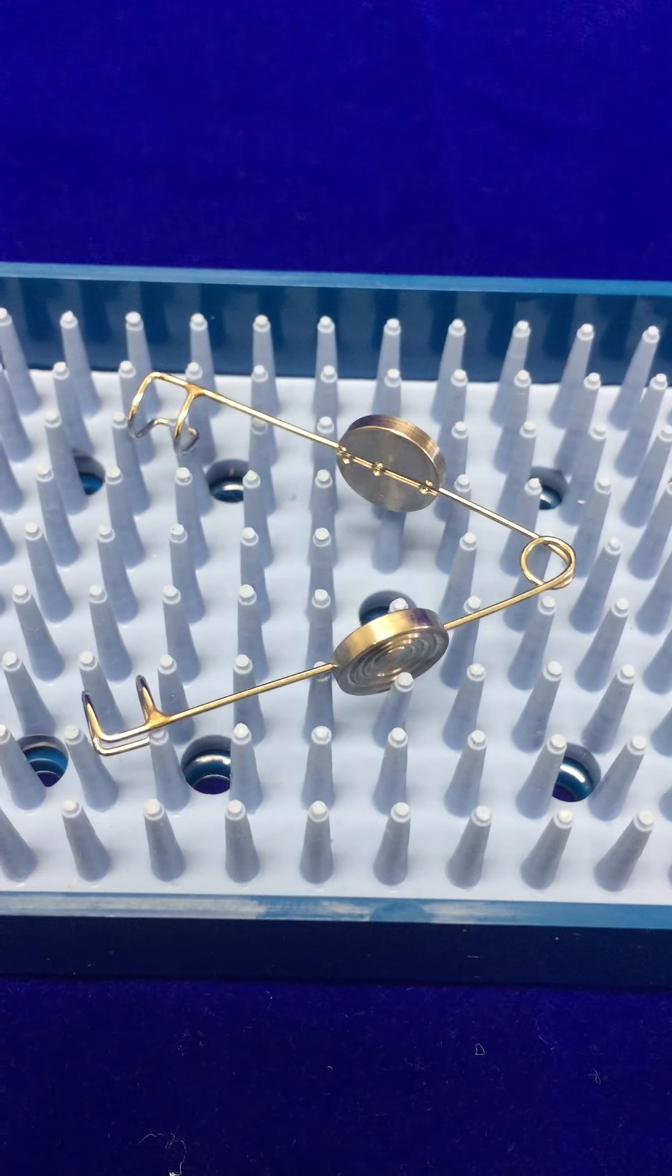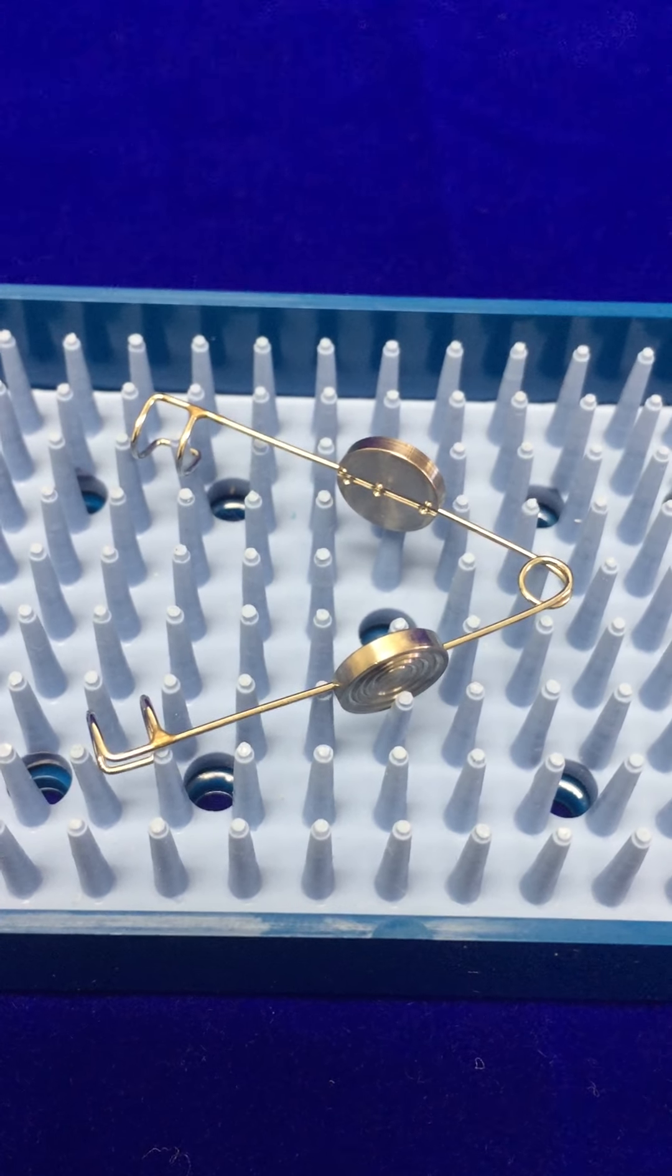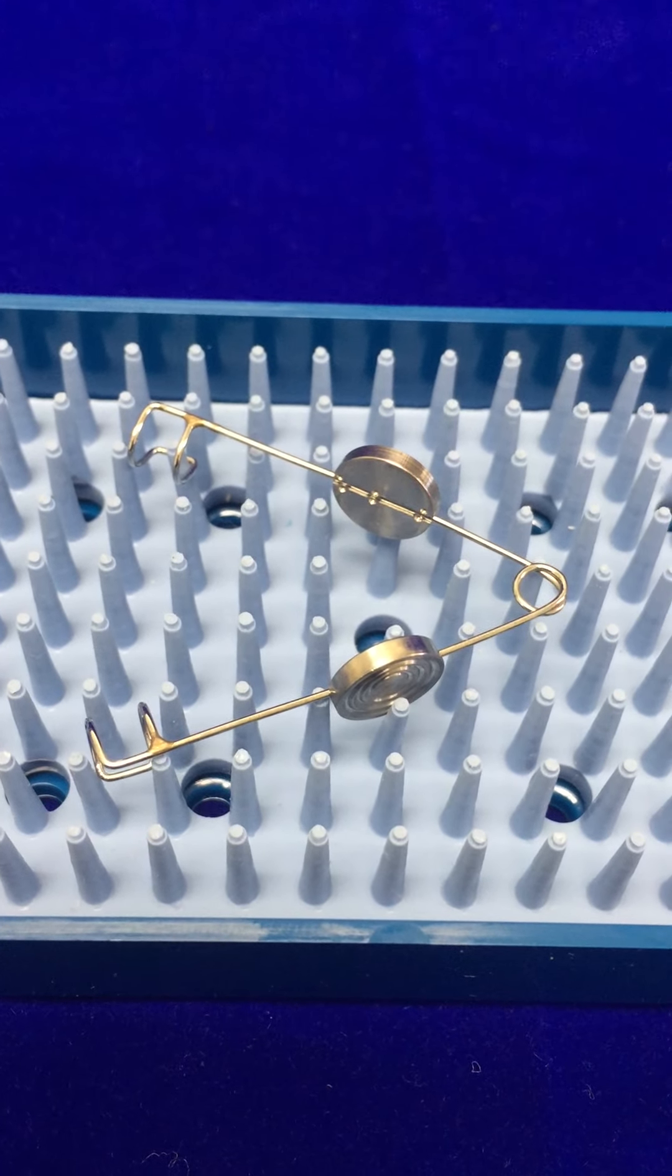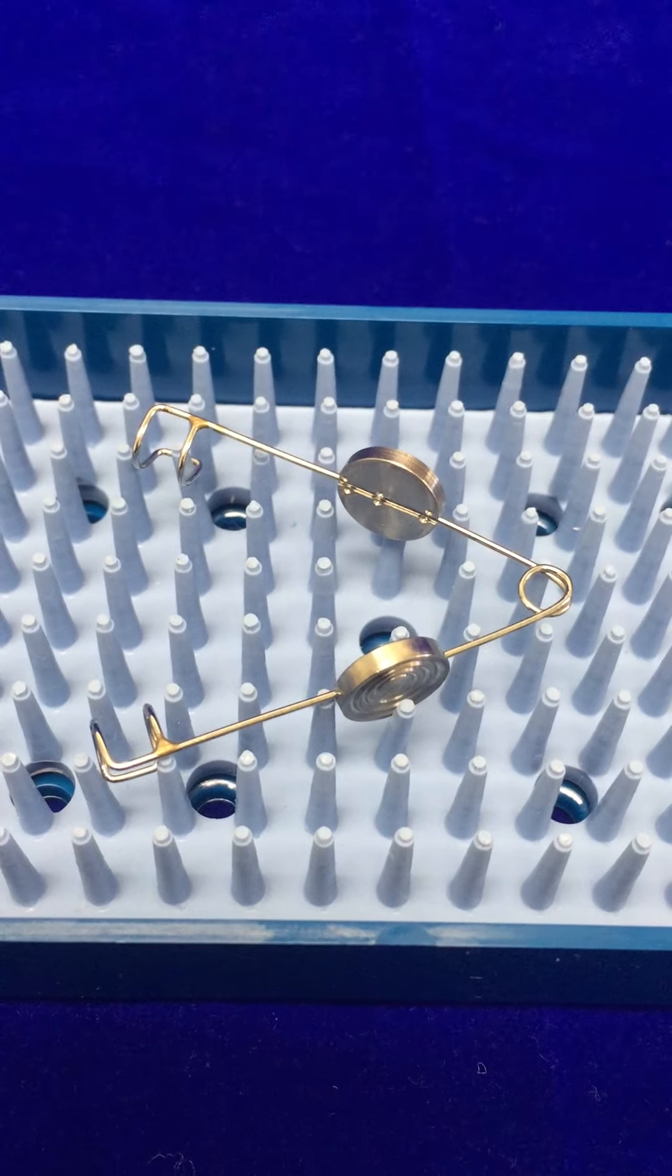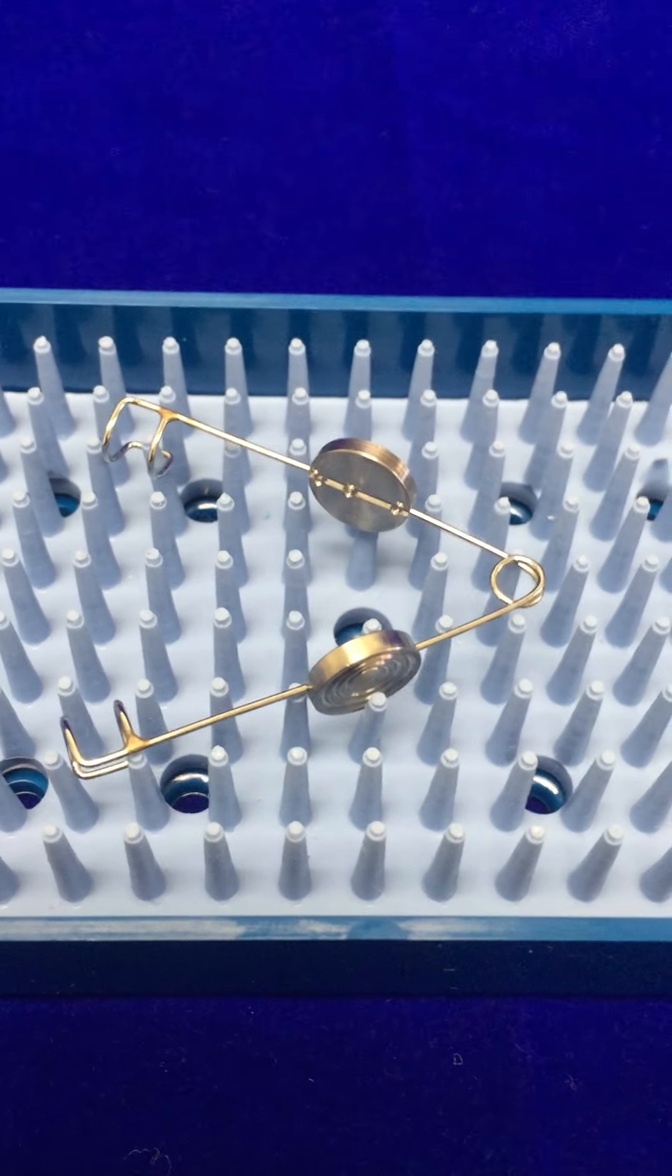Hello everyone, my name is Nick with Accuspire.com. Today we're going to look at our Alfonso speculum.